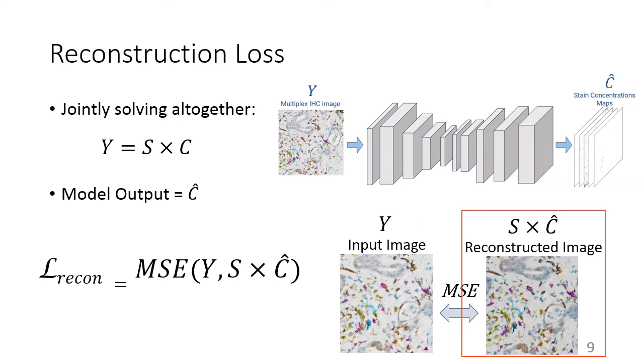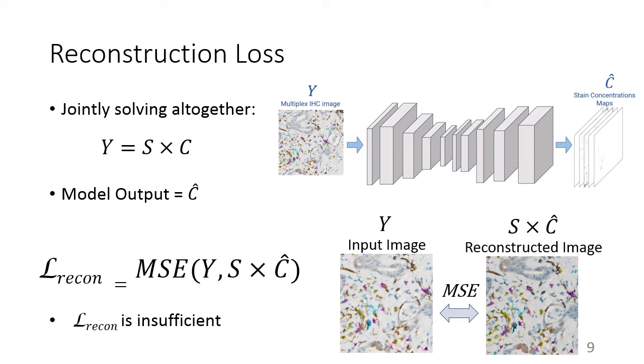But the reconstruction loss is insufficient to train our model. When the number of stains is larger than 3, there are infinite solutions that satisfy the reconstruction loss function. Thus, we need additional supervision.